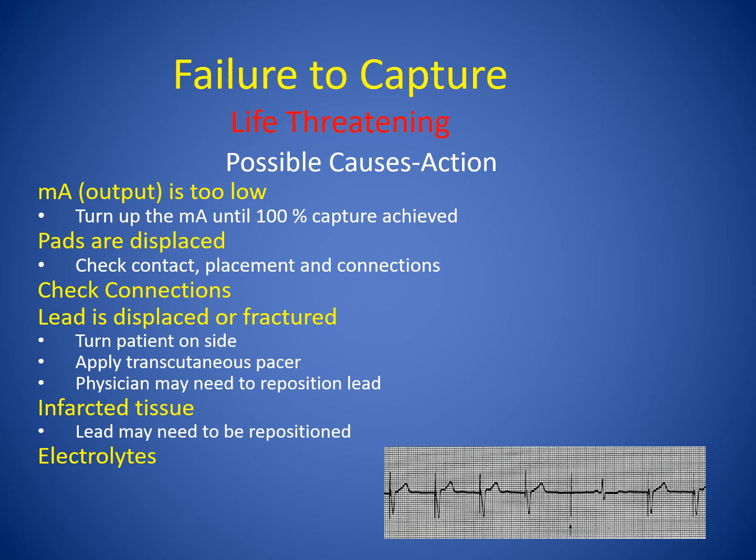Other things that can cause it: if the pads are displaced. If you have an external or transcutaneous pacer, you want to check the contact, and make sure the pads are not dried up and you have a good conductant. If you have to, replace the pads and make sure the connections are all intact. So, checking your connections.